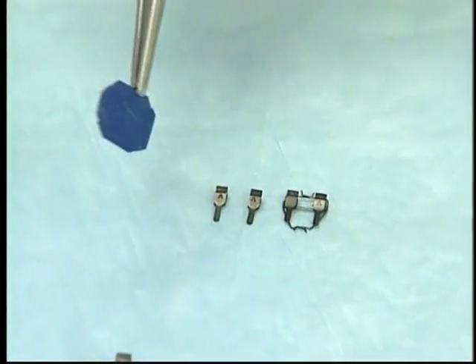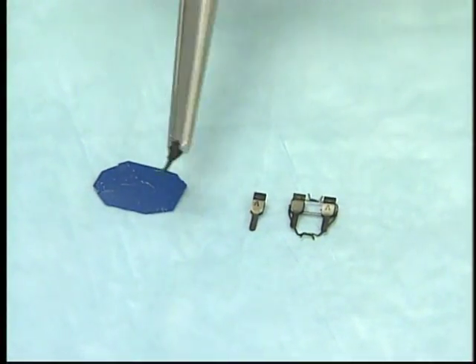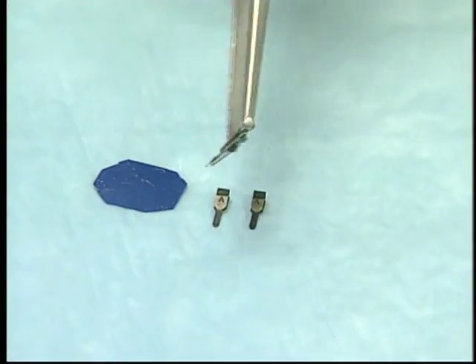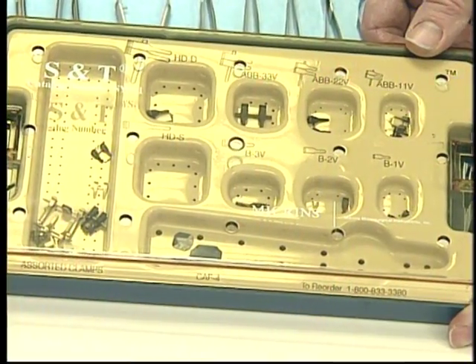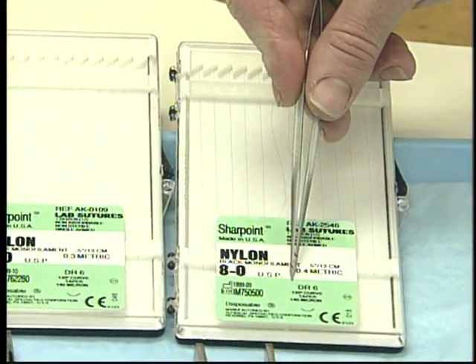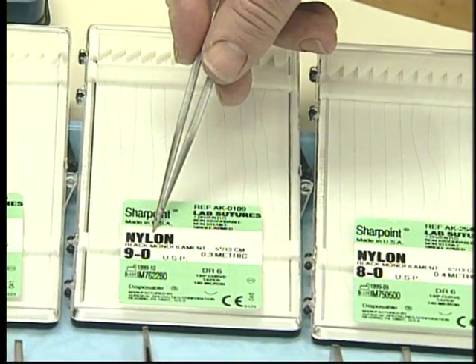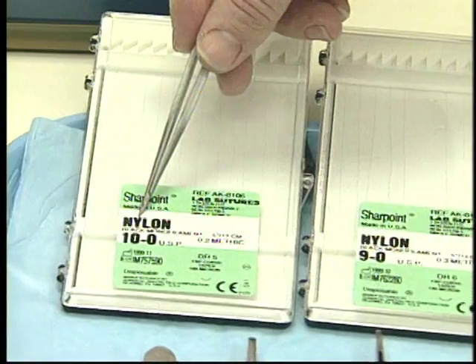Next, we have blue background material. We have single vessel clamps and a double vessel clamp. In order not to lose these clamps, it's helpful to have a clamp tray in order to maintain all of our clamps. Of course, no microsurgery set would be complete without 8/0, 9/0, and 10/0 nylon, the 10/0 being the finest of the nylon sutures.